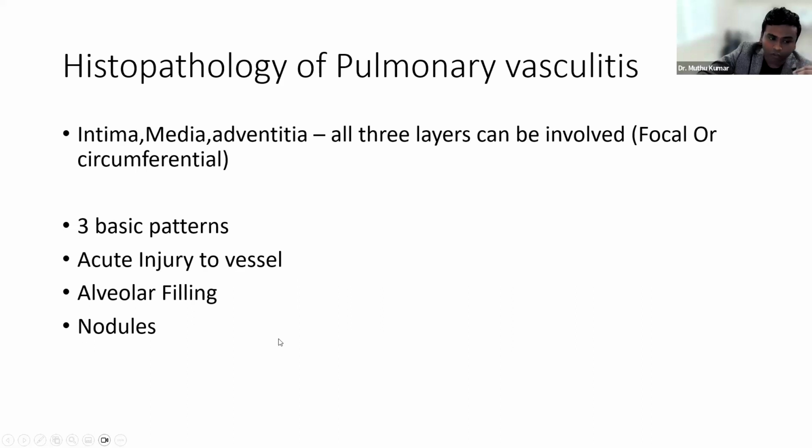It's very important to not forget the airways, which are always traveling along the blood vessels. In many cases, I have seen people are more focused on vascular findings, but they totally miss the pulmonary findings. And by pulmonary findings, I mean not only the segmental airways, like consolidation and all that, but the larger airways like the trachea also need to be seen.